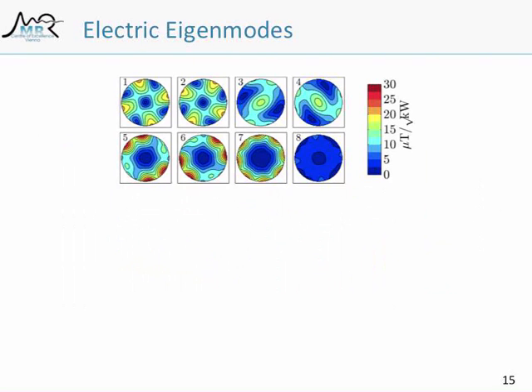So that's why you can look at it on the basis of those modes, and you see, okay, those 2 modes give me sensitivity in the center. And here I get nothing in the center from those modes. I only get some signal in the periphery. The same here, I get more signal in the periphery.